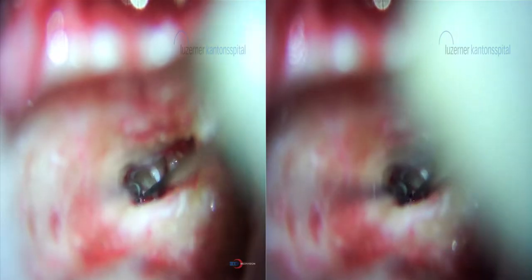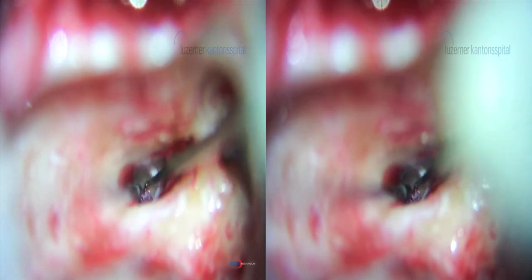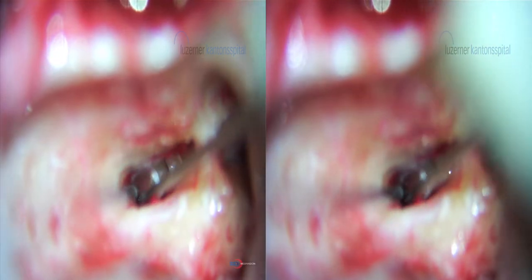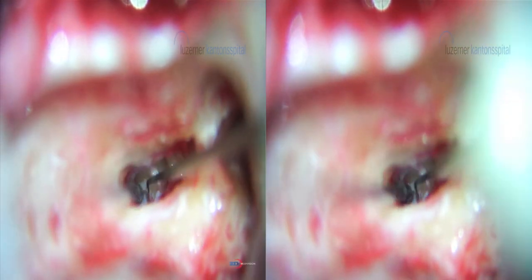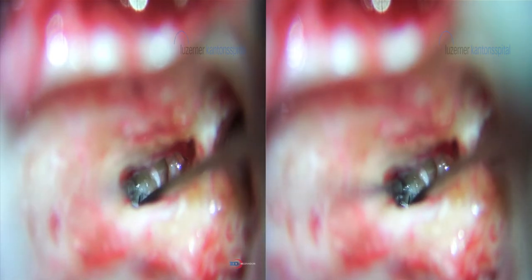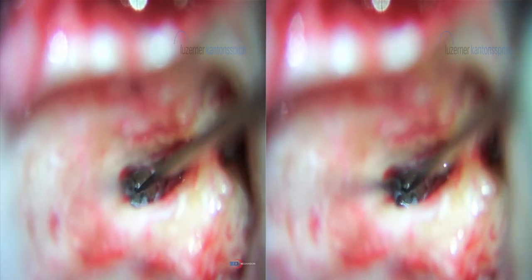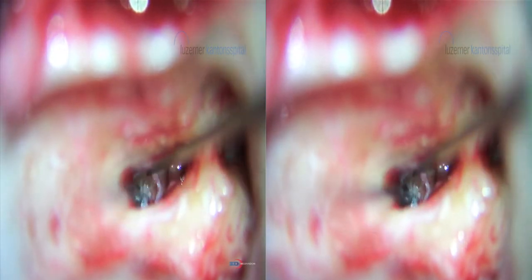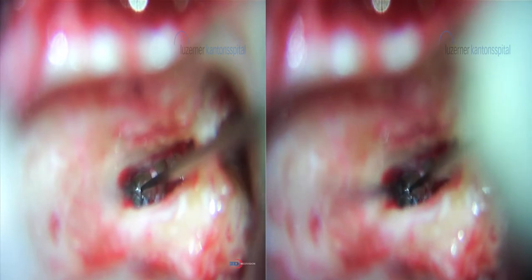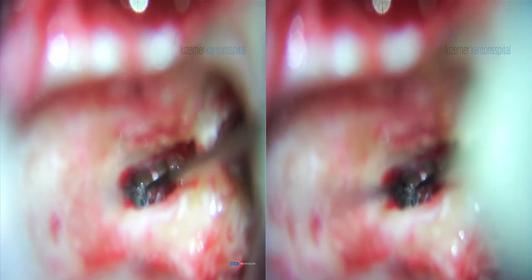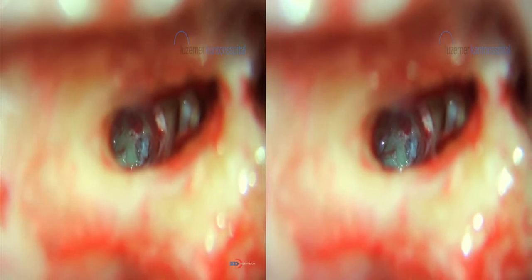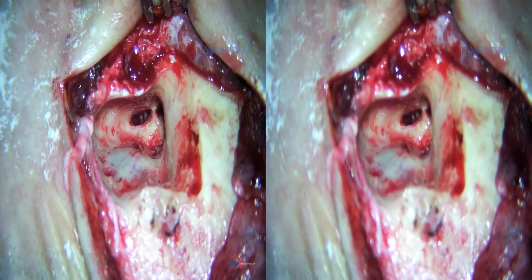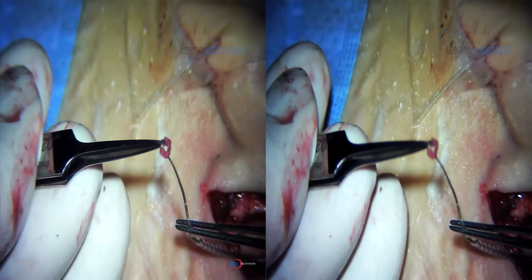The chorda tympani is inferiorly and anteriorly and is preserved. The false membrane is removed from the round window niche to identify the proper round window area and round window membrane. There is most often a false membrane hiding the true round window membrane. Bony lips are removed to see clearly the full view of the round window.